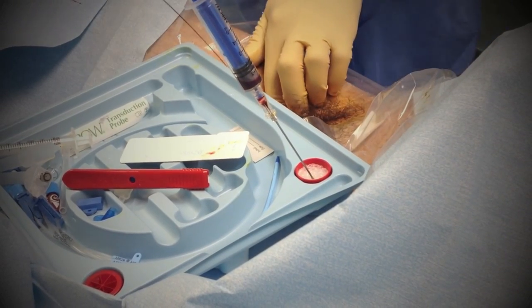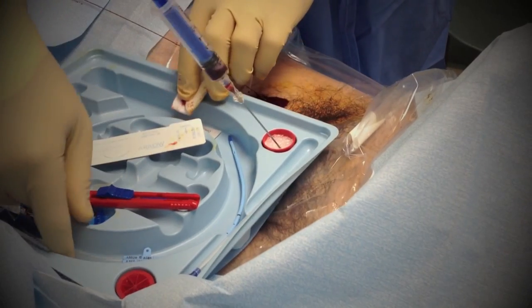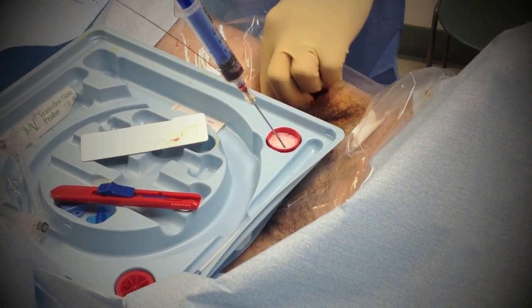So we're dilating the vessel. The guide wire stays in place, and then this is the triple lumen. We'll just dilate that vessel.